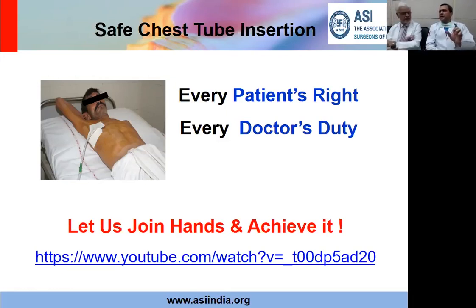It is mid-axillary, or a little bit on this side or that side, which of course I will modify according to the body habitus of the patient. Also, remember, you should imagine the patient in a lying down position and never have the chest tube coming out of the area that will be touching the bed when the patient lies down. Sometimes I've seen a chest tube put on the back side, and when the patient lies down, the tube gets pinned because the patient is sleeping on the chest tube. That is very, very important.